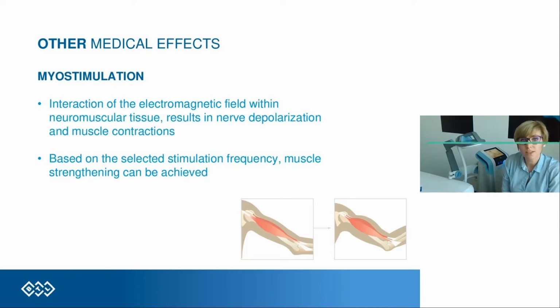And myostimulation, this is like the basic point you might have had in your mind if I told you about the depolarization of the nerve and muscle stimulation. So depending on the intensity we apply, we will decide what kind of stimulation we want to reach. Because myostimulation doesn't mean only strengthening the muscles. We can also relax the muscles, but this is up to the specific frequencies and the specific intensity level.